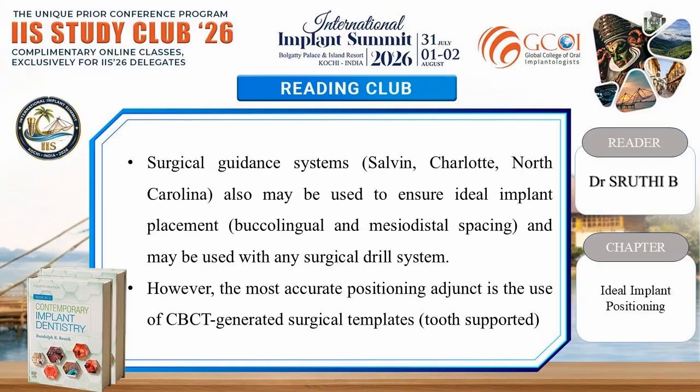Surgical guidance systems, Salvin, Charlotte, North Carolina, also may be used to ensure ideal implant placement, that is buccolingual and mesiodistal spacing, and may be used with any surgical drill system. However, the most accurate positioning adjunct is the use of CBCT-generated surgical templates, that is tooth supported.